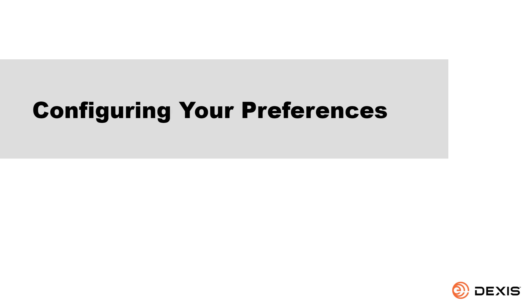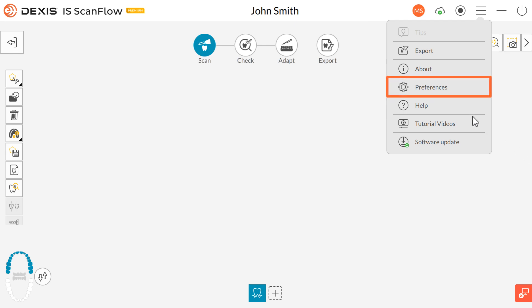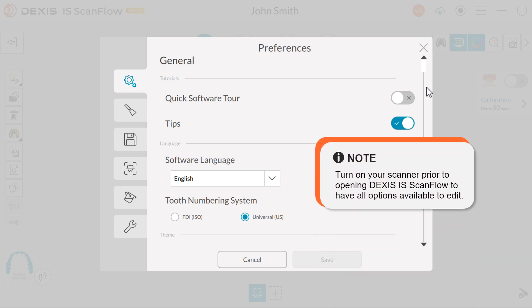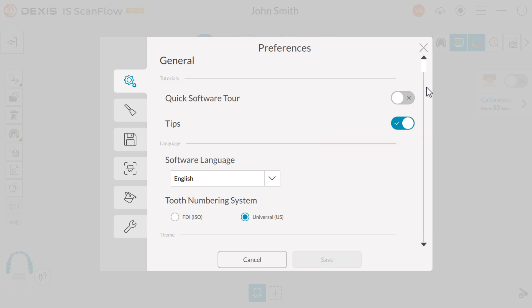Configuring your preferences. Click to open the Preferences menu. The Preferences dialog box enables you to select DEXIS IS ScanFlow interface and scanner settings. It is recommended to set up your preferences before using the scanner. Note: turn on your scanner prior to opening DEXIS IS ScanFlow to have all options available to edit. There are 6 preference categories: General, Device, Save, Scan, Color, and Tools.